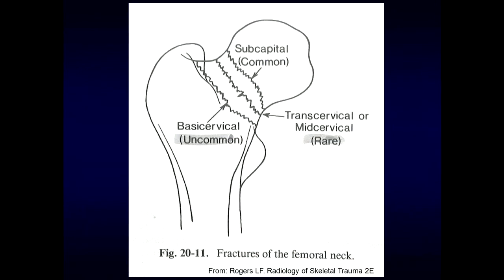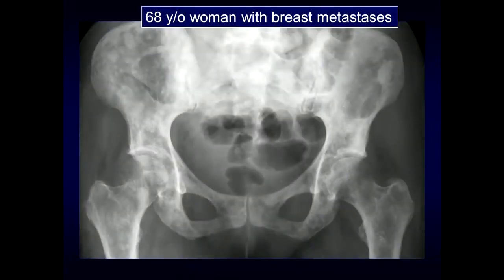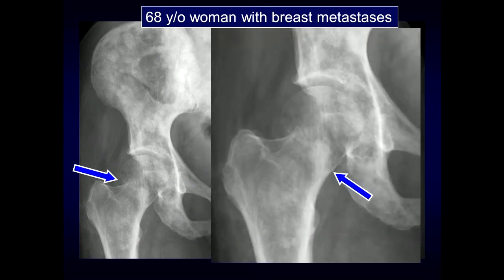The most common femoral neck fracture is the subcapital fracture. You can also have a transcervical or midcervical (rare) or a basicervical (uncommon). These femoral neck fractures can be very subtle — magnify and take a close look. In one patient, subtle offset is visible along the medial aspect of the femoral neck. In a 68-year-old woman with breast metastasis, there is subtle irregularity at the lateral aspect of the femoral head-neck junction, with the fracture extending to the medial aspect of the femoral neck.